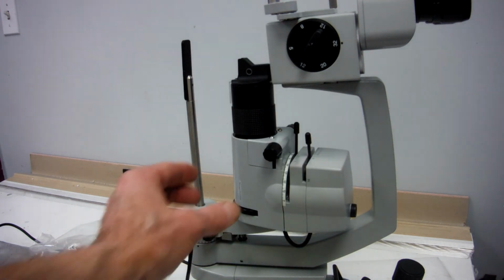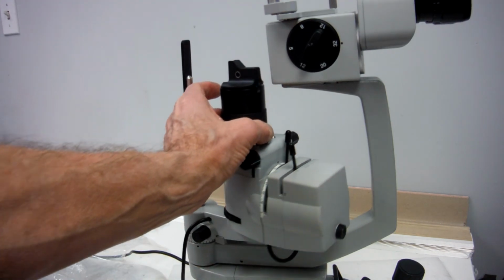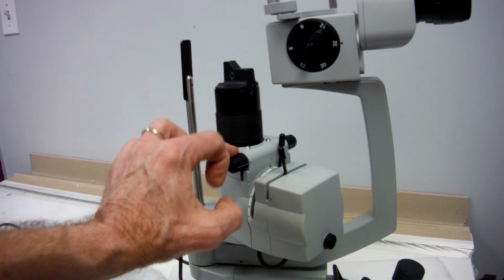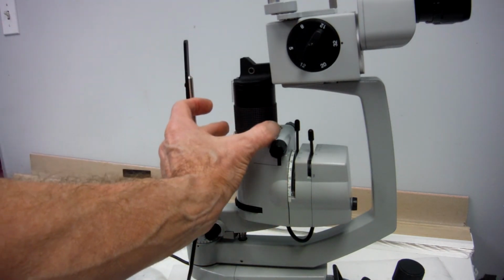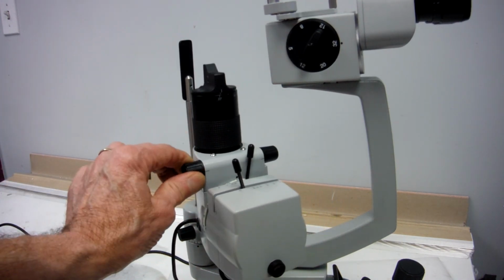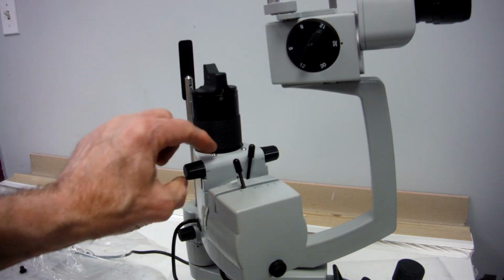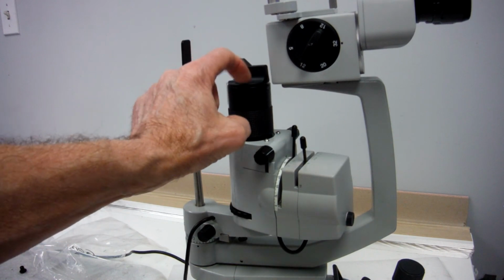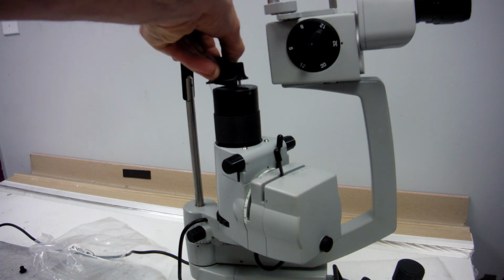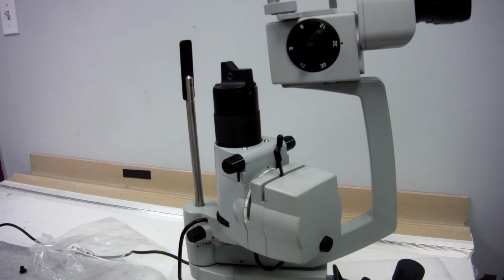So those are some quick, simple little adjustments you can make, and if you can, try to make those adjustments before you make other adjustments by raising the prism up underneath here and centering here, centering on the focusing rod here. Try to make as many adjustments as you can in these simple ways before you go deep inside.